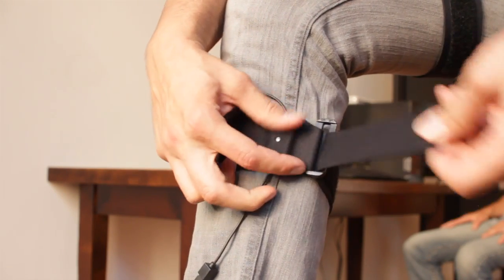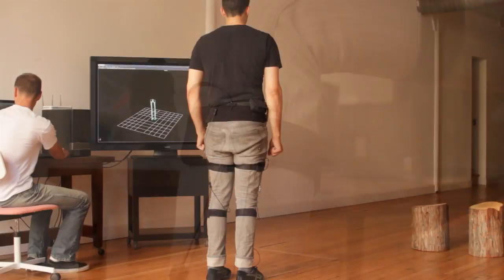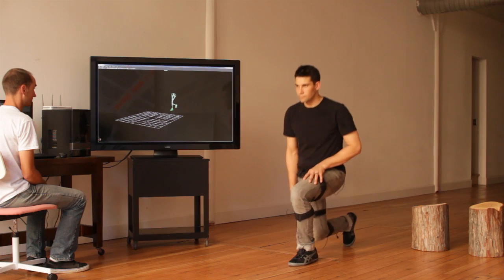The sensor straps are easily attached and removed for efficient use in the studio, clinical environment, or in the field. After a short and simple calibration process, position and rotation data can be recorded to onboard storage or streamed in real time to a PC.